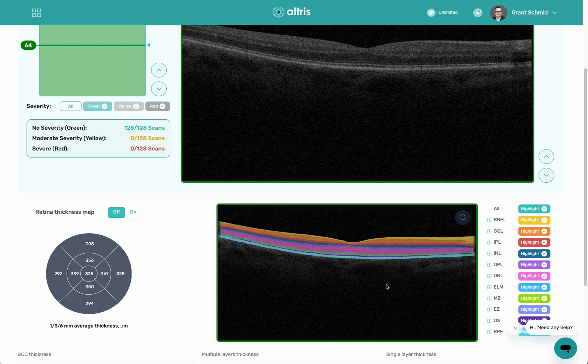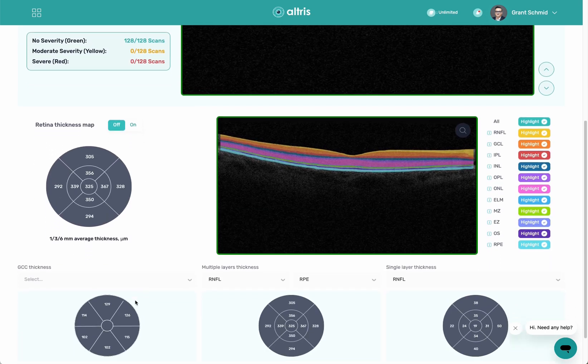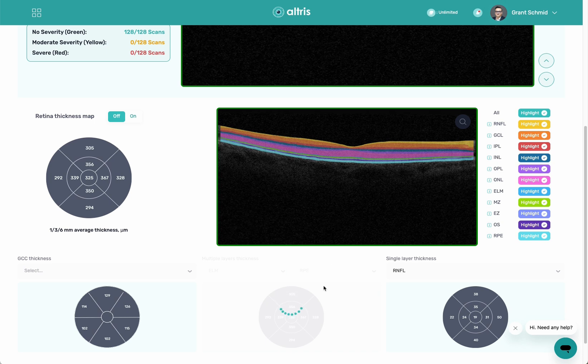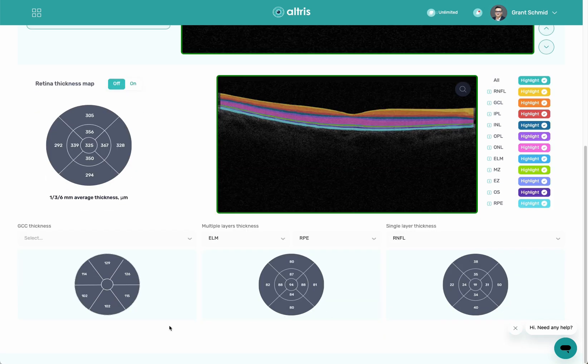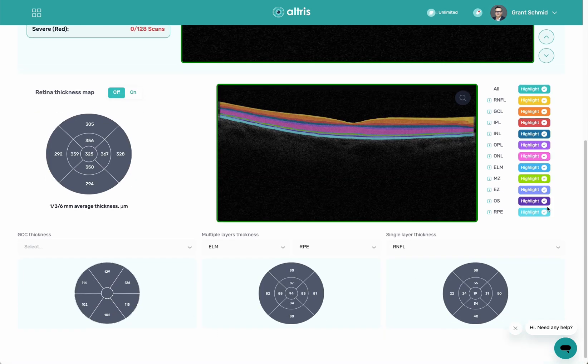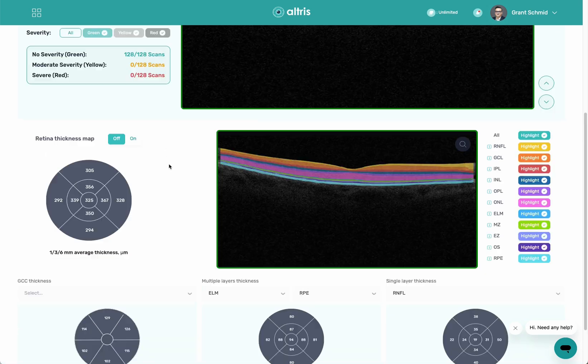What we've done instead is we've created our own segmentation, and we're looking for pathology and biomarkers. We've taken tens of thousands of labeled OCTs and fed them in using supervised machine learning to teach the algorithm to look for things. So instead of looking for normal, we're looking for pathology, change, and biomarkers. You can see I can look at thickness maps, thickness between different layers or single layers, as well as turn on and off individual segmentation.